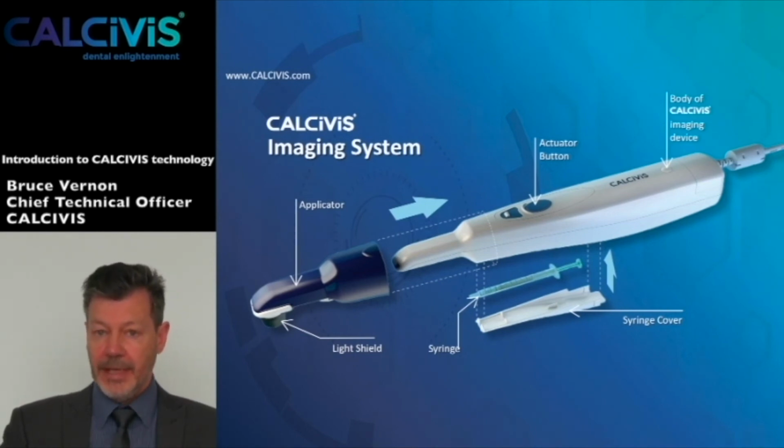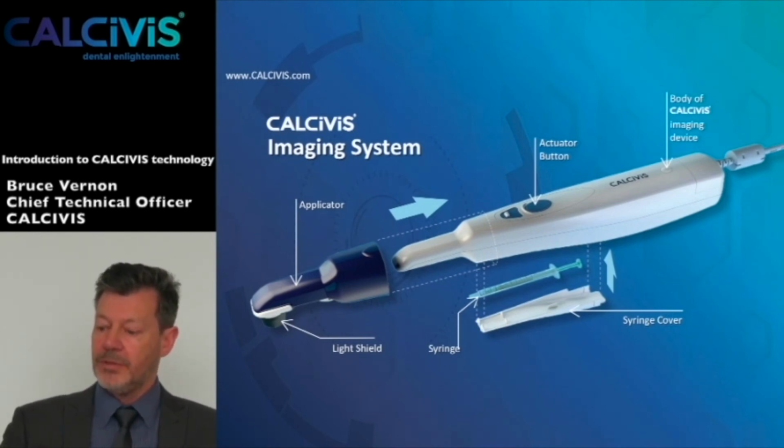So by positioning it over the tooth surface of interest, we can get a live video stream. And what I'll do is I'll show you a brief video clip just showing what this looks like in practice.